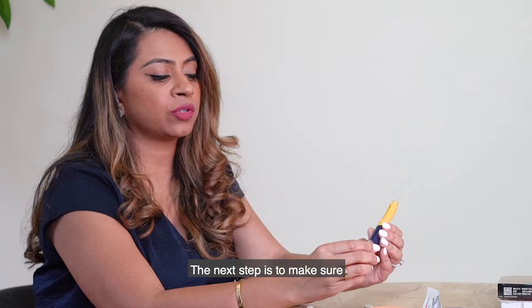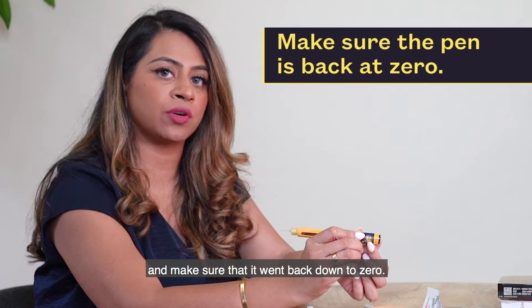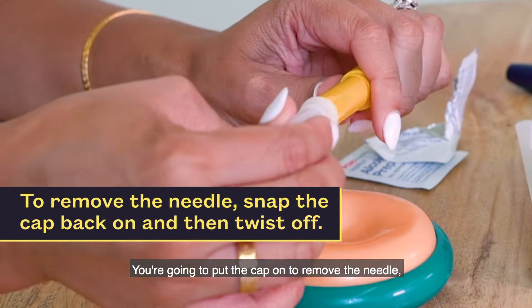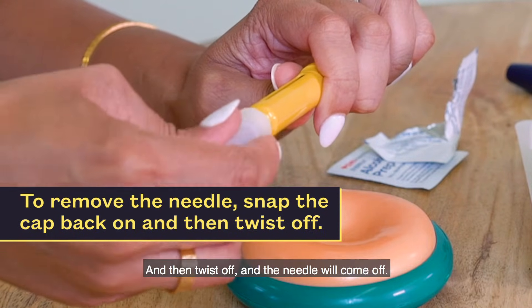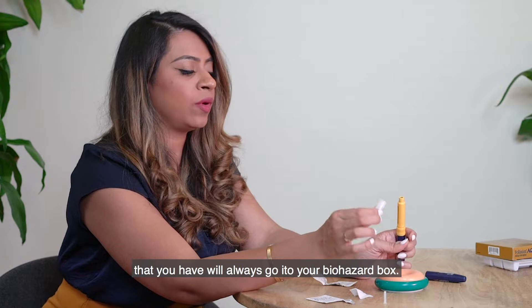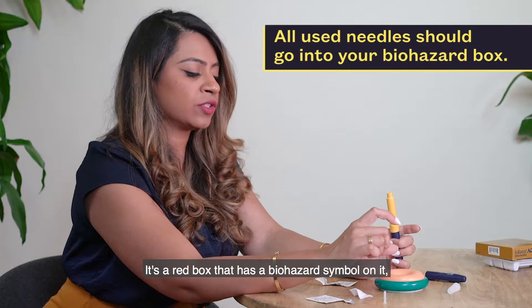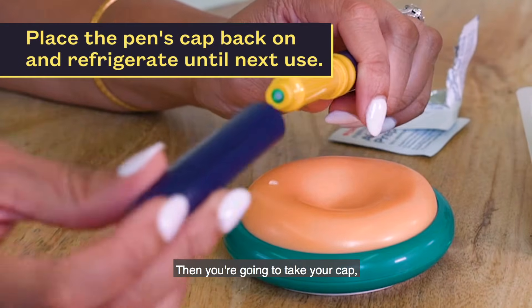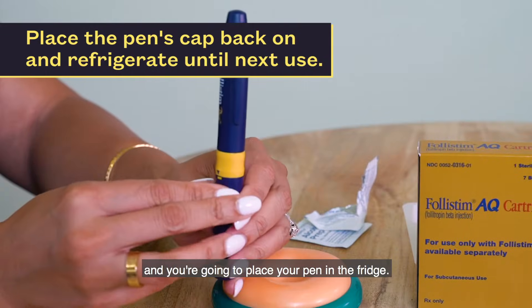Next, make sure you got all of the medicine by looking at the dial to confirm it went back down to zero. If it says zero, you've received all the medication. Put the cap on to remove the needle — push down tightly and then twist off. Place the needle into your biohazard box, which is the red box with a biohazard symbol. Then place the cap back onto the pen and put the pen in the fridge.